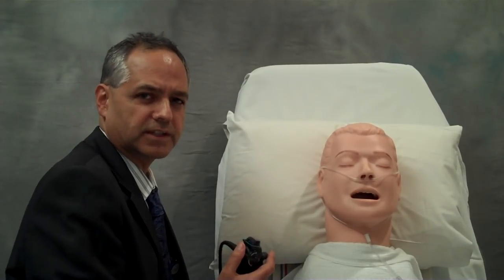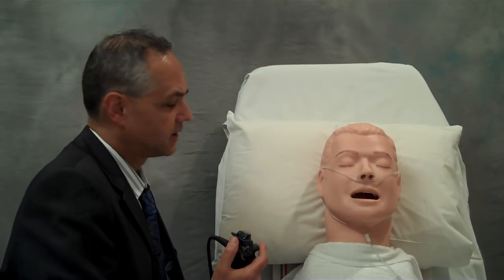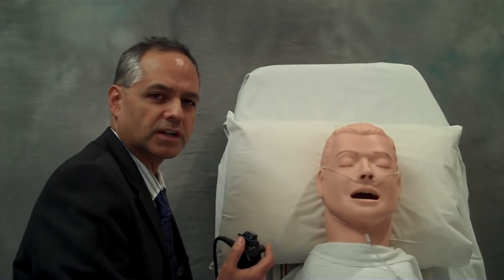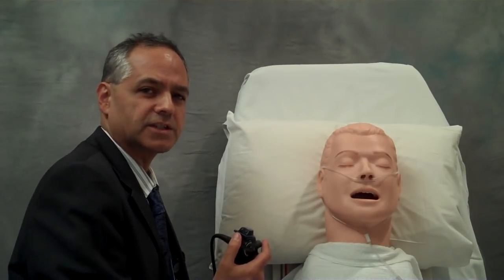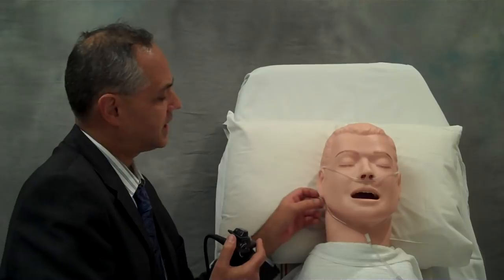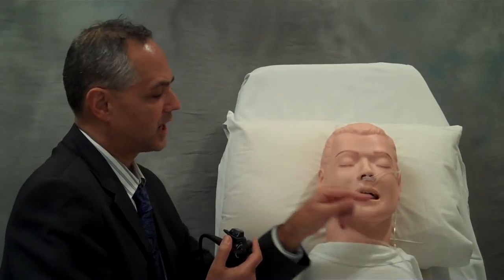Sometimes it's not possible to intubate easily through the mouth. This may be because of a large tongue, a thick neck, or excessive soft tissue. In those cases, we can still intubate through the nostril.